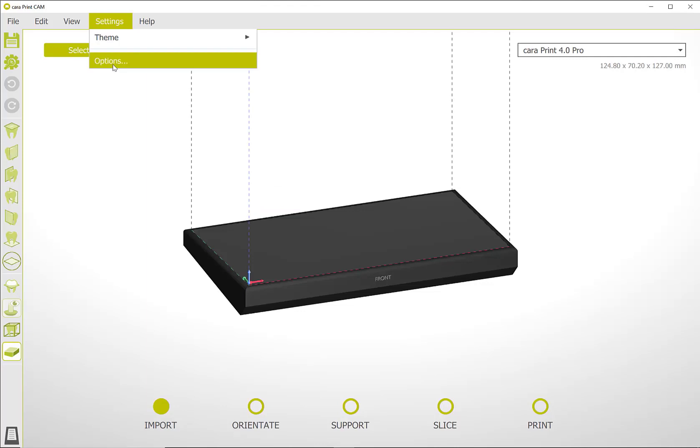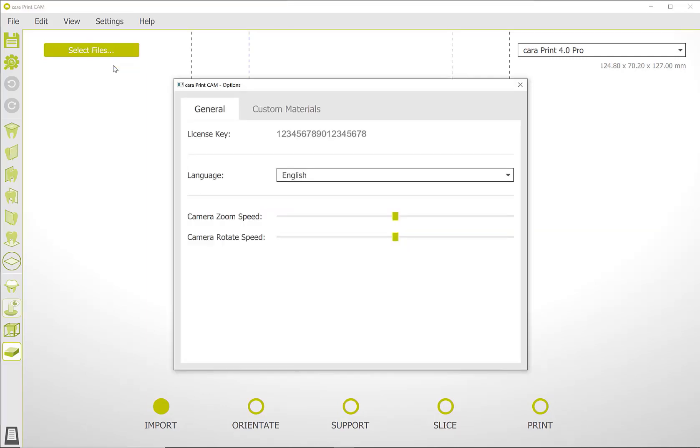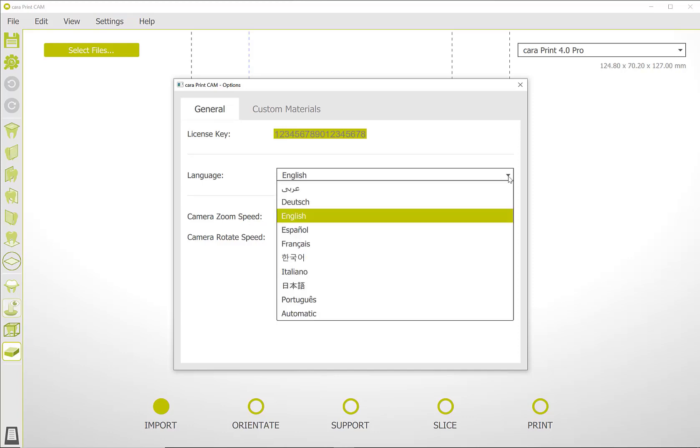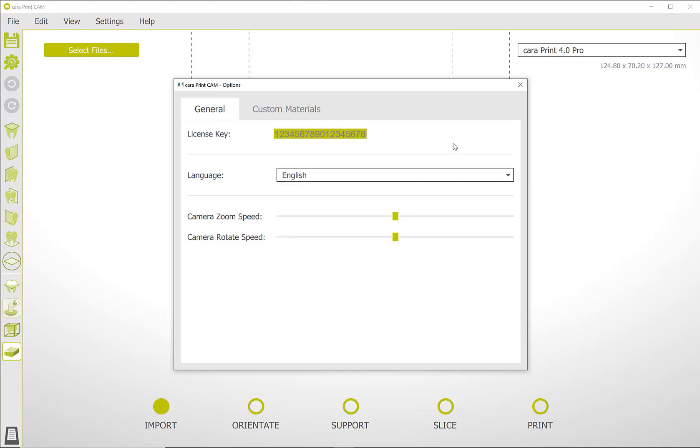Under Options you can always find your license key. Here you can also change the language selection at any time. With the two lower sliders you can adjust the speed of your mouse movements. The upper slider is for zooming with the mouse wheel and the lower slider is for rotational movement.